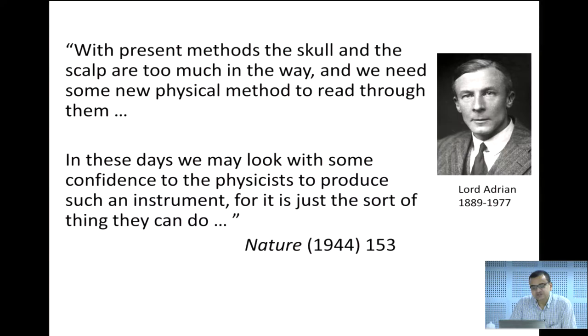Yesterday we talked about how, if the contacts between the electrodes and the scalp are not very good, your signal becomes very noisy. This is quite a funny comment I found, published almost 70 years back by Lord Adrian. He mentioned that with present methods, the skull and the scalp are too much in the way, meaning in the way of the signal reaching the recording apparatus from the brain. He said we need some new physical method to read through them, and these days we may look with some confidence to the physicists to produce such an instrument, for it is just the sort of thing they can do.